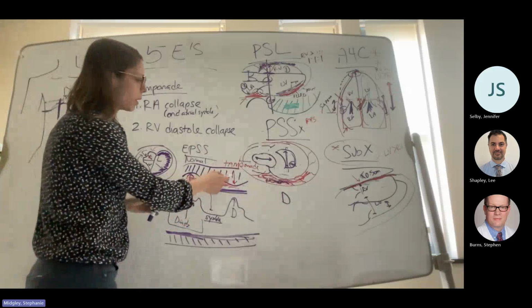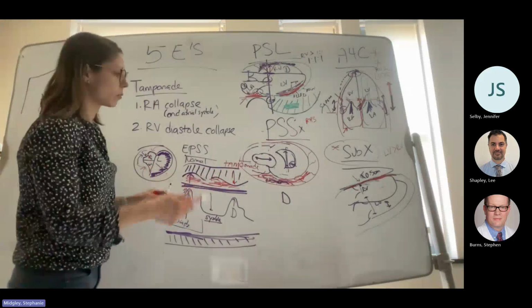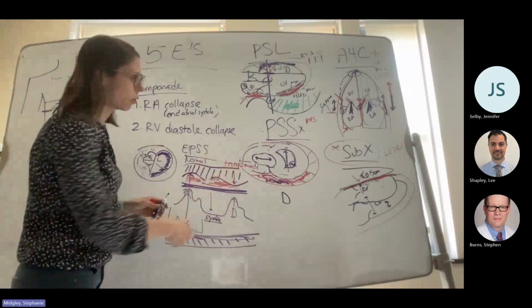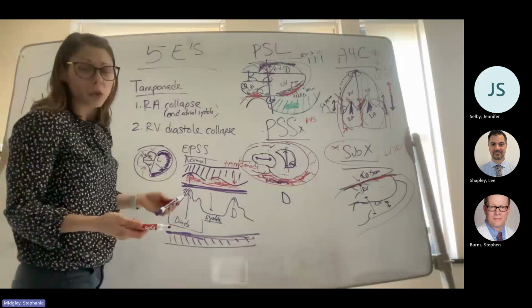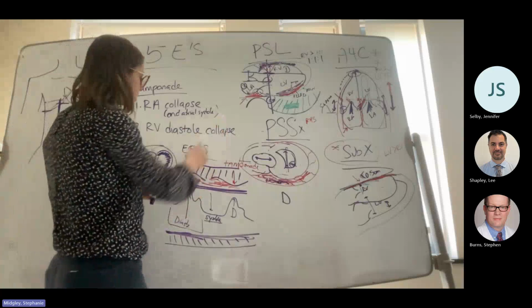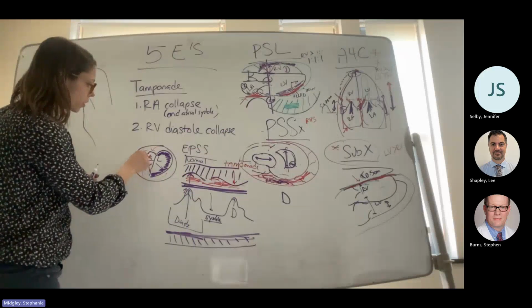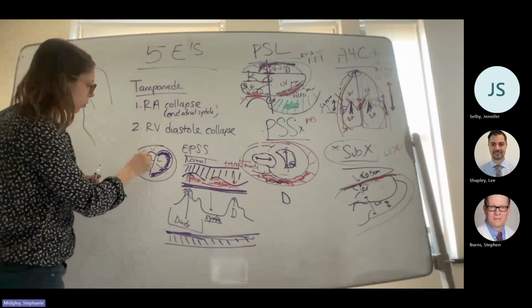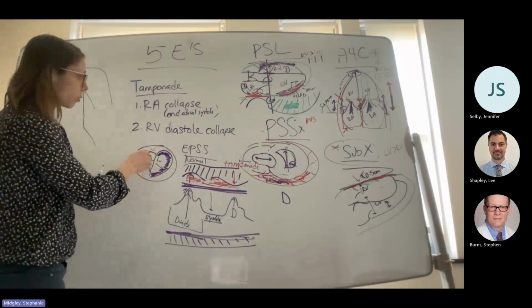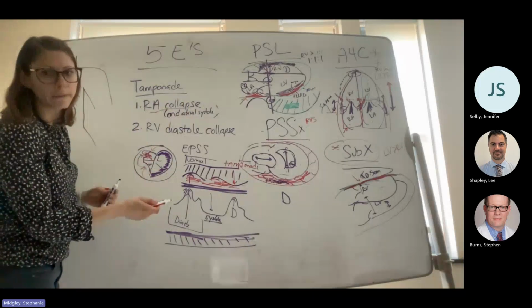I'm going to just say tamponade's a fluid state. It's very preload dependent. So if you have somebody who came in because they syncopized, they're a little volume down, they've got a pericardial effusion, you do your echo and you're like, oh crap, there's tamponade. What do we do? We try to temporize them. We give them fluids. So now you increase the preload of the right side of your heart, which increases the pressure inside the heart and gives it more strength to push against that fluid. And so you could take them from early tamponade with right atrial collapse, give them fluid and it'll go away.